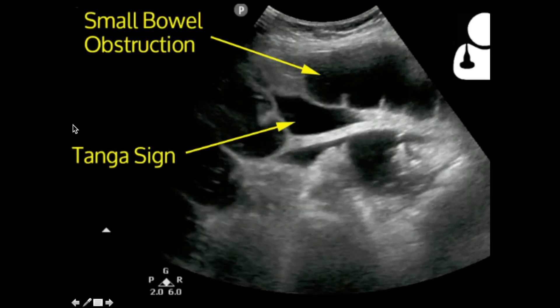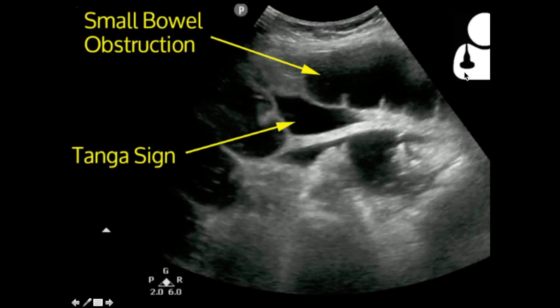On this last still, we can see our fifth and final sign that we look for in a small bowel obstruction, called the tanga sign. Here we have some small bowel — we can actually see some keyboarding again — and then here we have some free fluid. The tanga sign is two loops of bowel with free fluid between them. This is due to increased intraluminal pressure, which pushes against the walls, increases permeability, and allows some fluid to leak out. Credit for this slide goes to Ben Smith, since he took this image.